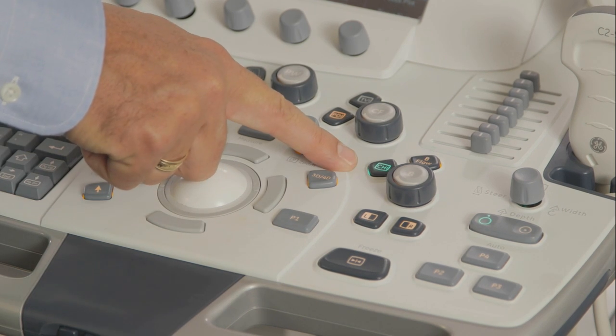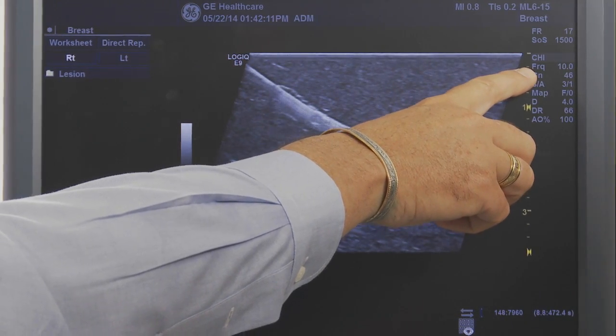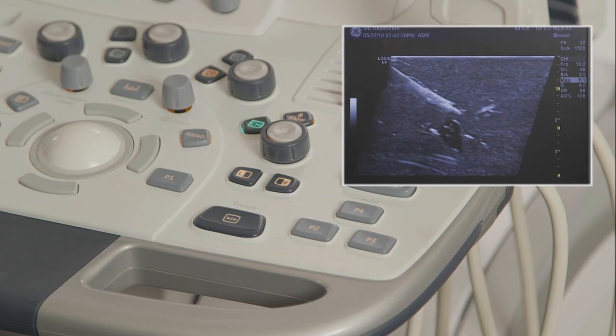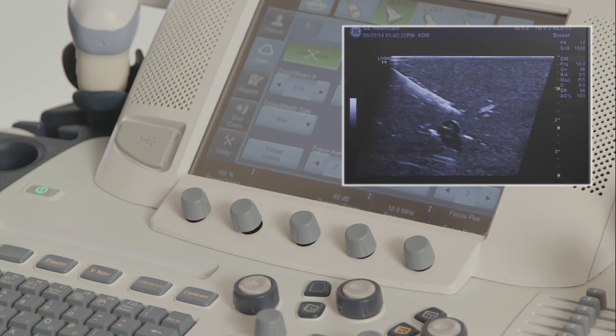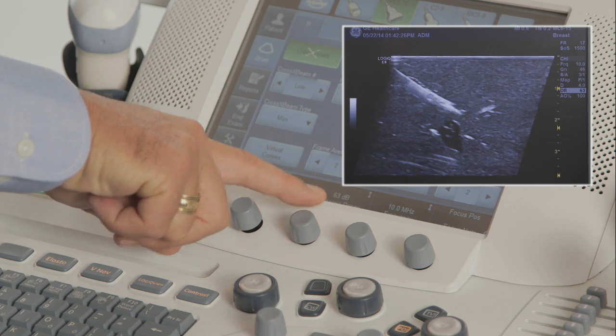Remember to use harmonics, as we want the best image quality during the needle procedure. Turning on ATO or auto-optimize can improve image contrast and needle perception. Also, lowering dynamic range can increase image contrast and allow better visualization of the needle.